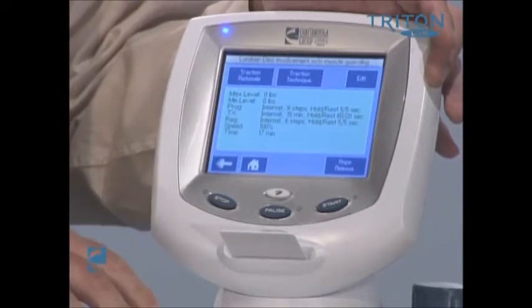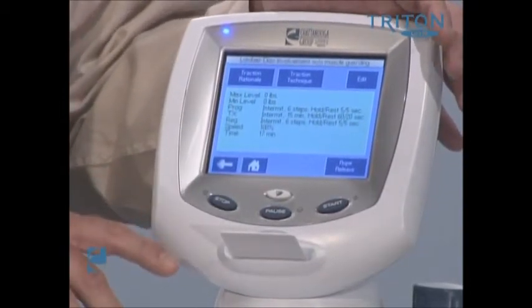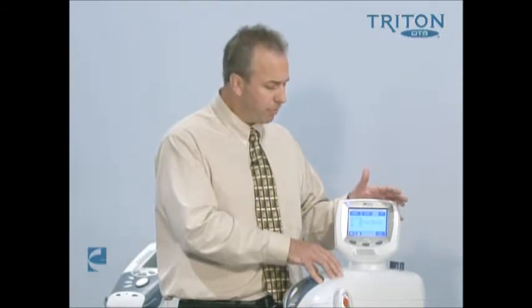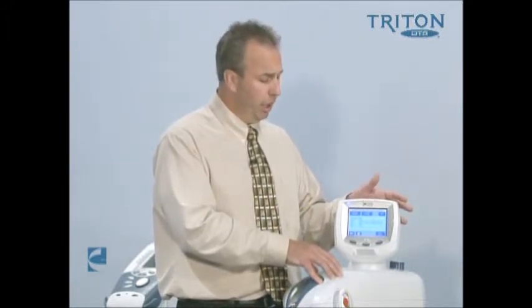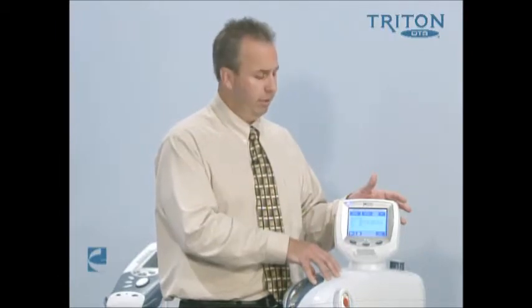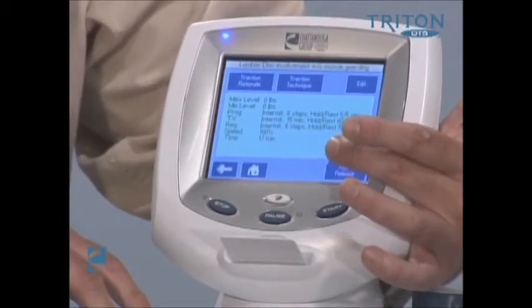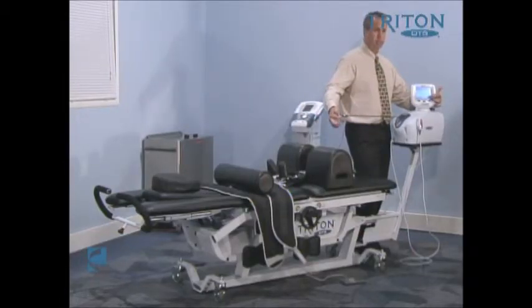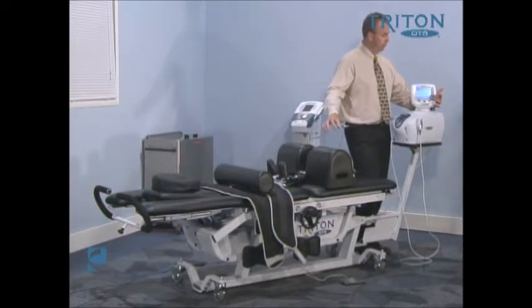After we've completed editing the parameters, we can go back and simply start from that screen, or we can go back and reevaluate the parameters to determine if anything else needs to be changed. Once everything is established, we have an opportunity to adjust the patient. There's a rope release switch here which we use whenever we're ready to attach the patient to the device. We just release it and it will pull the tension so we can begin the treatment.